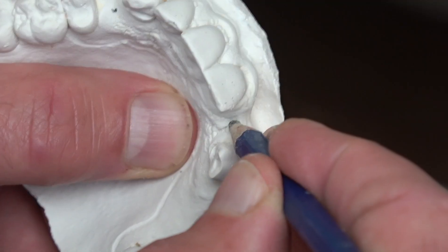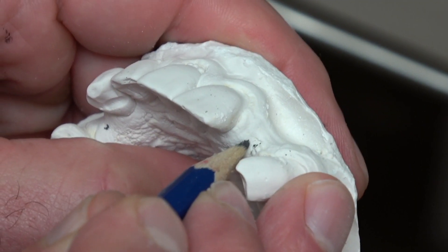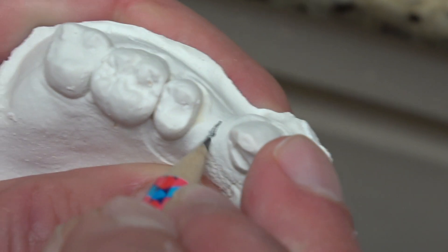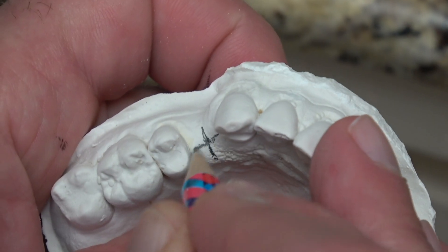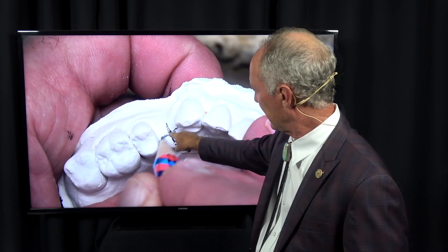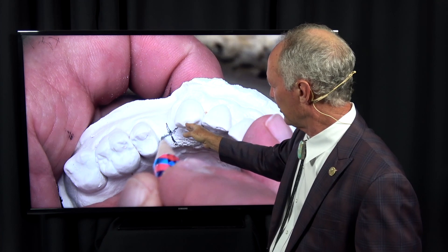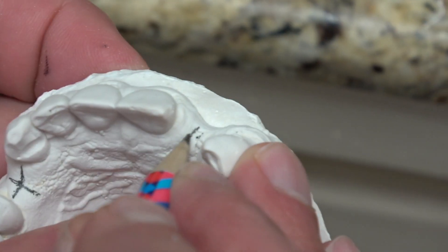This is the study model. You first place a mark at the exact point where you want to place the implant — right in the center — making a plus sign. One line is in alignment with the adjacent teeth and the other is between the adjacent teeth. When making your pilot hole, be sure to align with the roots and the coronal part of the tooth you want to use as your vertical alignment guide.